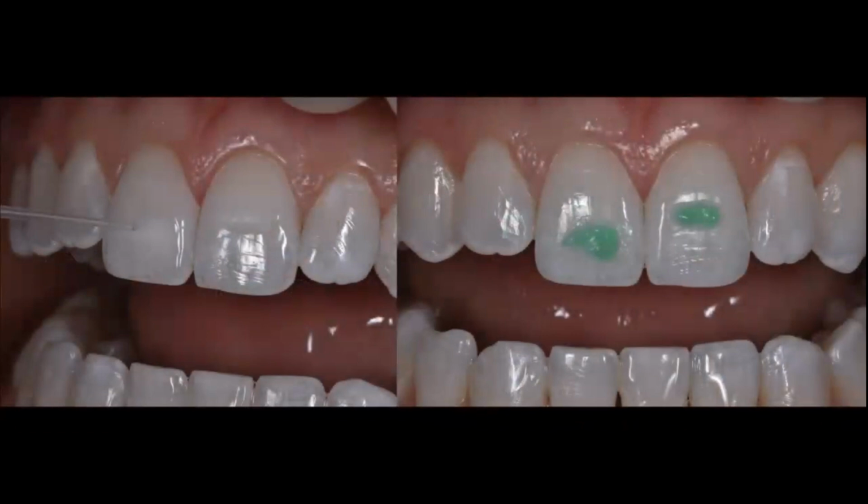And that etching is continuous. You're going to etch until you can't see the white spot anymore. So you're literally etching all the way through the depth of the white spot. That is the idea. That is the goal.